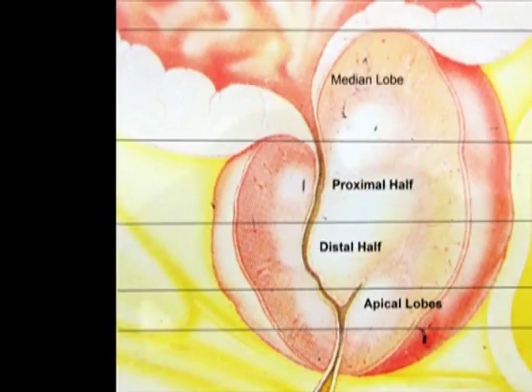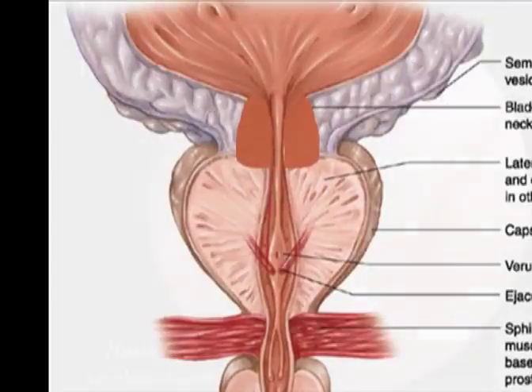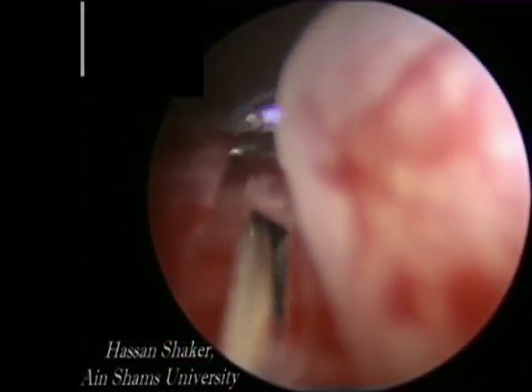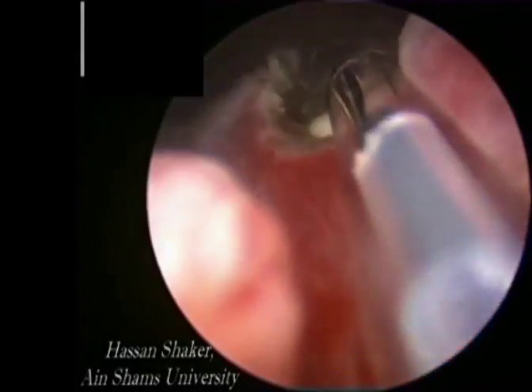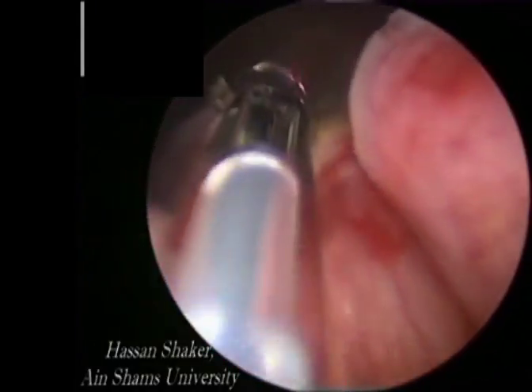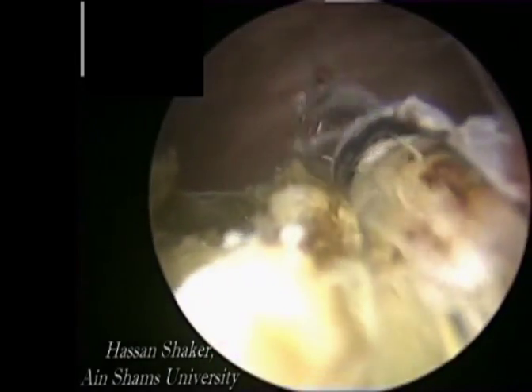We divide the prostate into four zones: median lobe, proximal half, distal half, and the apical lobes. We start by ablating the median lobe. The twister fiber works in contact mode — the more pressure is applied to tissues, the faster the ablation is. Fiber movement can either be a sliding movement or a rocking one.